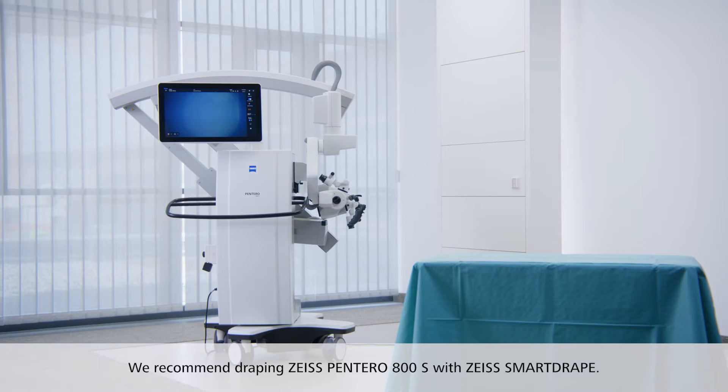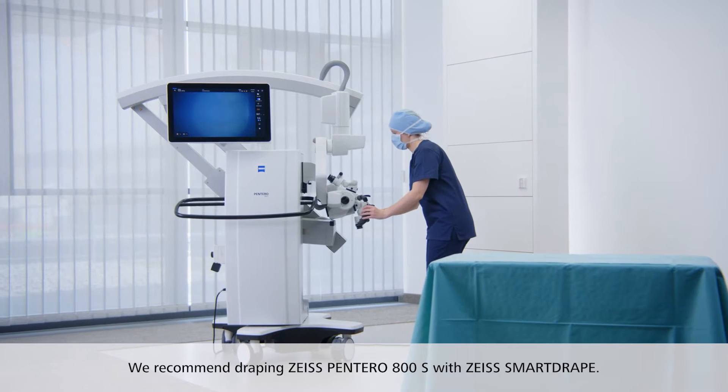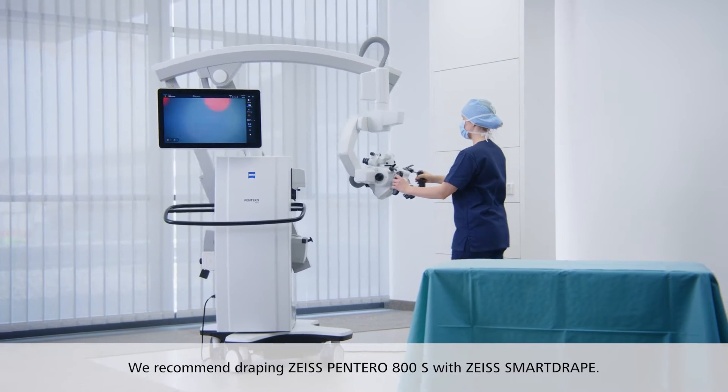To ensure sterile working conditions, excellent viewing clarity, and uninterrupted movement, we recommend draping the Zeiss Pentero 800S with Zeiss SmartDrape.